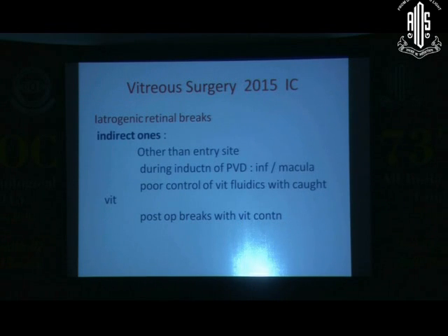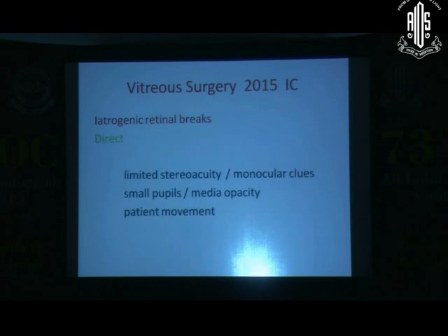Other indirect ways in which we can induce a retinal break is during induction of PVD, as I have mentioned. If cutters are not working properly, the vitreous can get caught up and get pulled up.